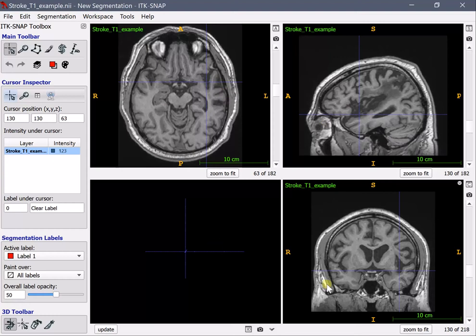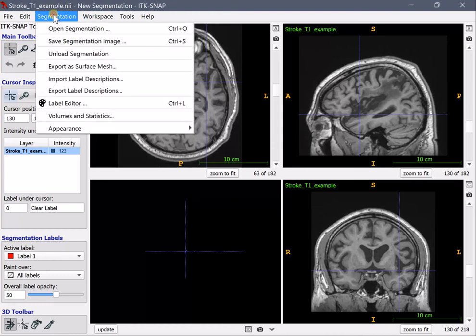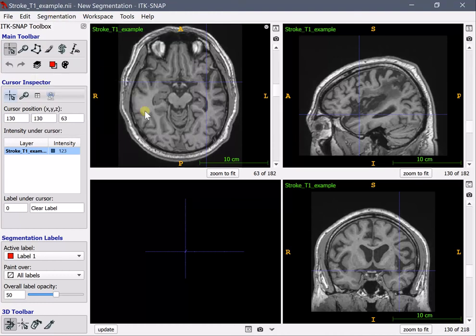Now the first step once you have formed an idea of how the lesion is created in 3D space you can start to draw the lesion. ITK snap has a segmentation feature and has a segmentation menu.